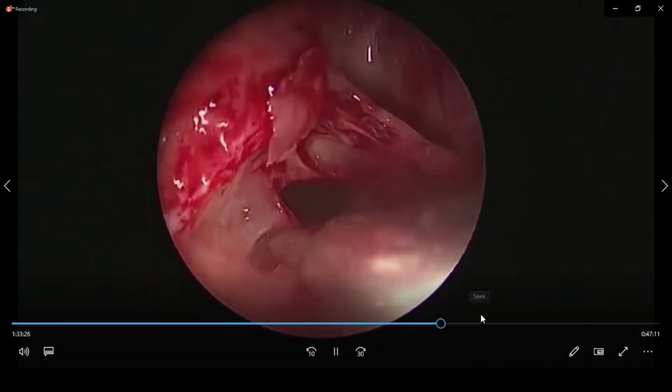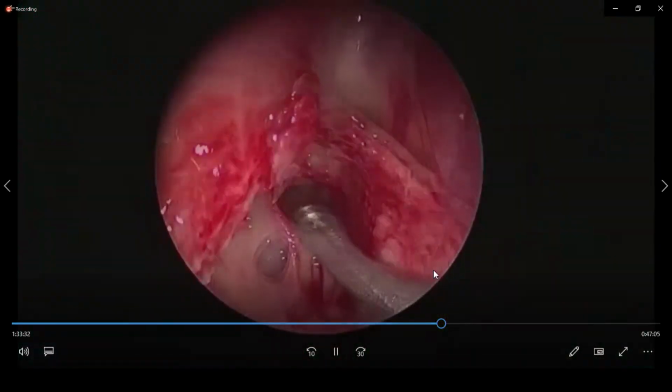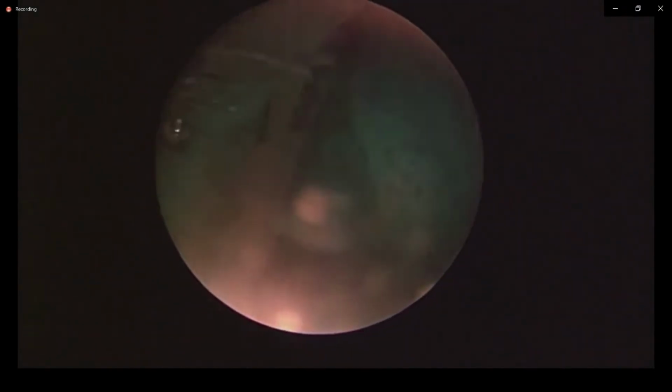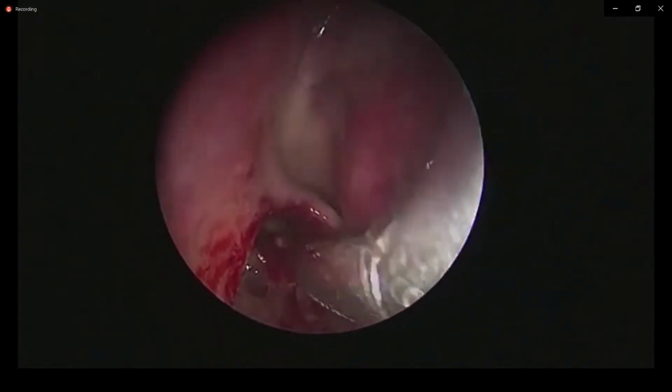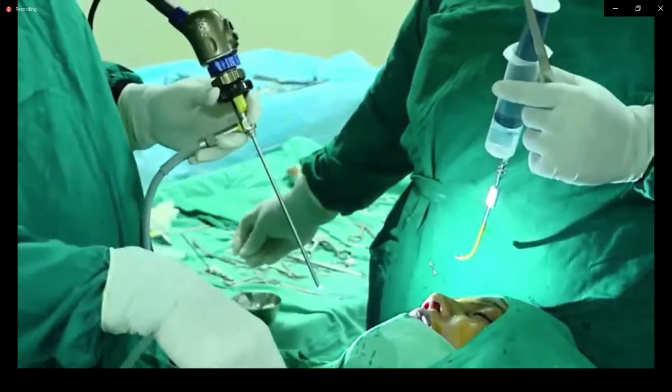See this? Now the frontal sinus opening is so big. Now we saw there was a supraorbital cell which further narrows it from laterally. We have to deal with that as well. So many cells in the same patient complicating the frontal sinus outflow. But once we remove all these cells, you will see finally how big the frontal sinus outflow can be to prevent restenosis or repeated symptomatology and the problem again and again.